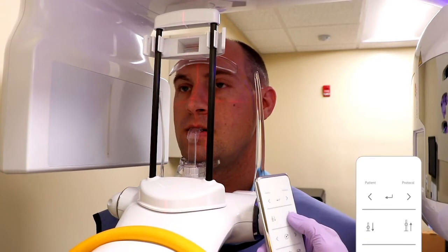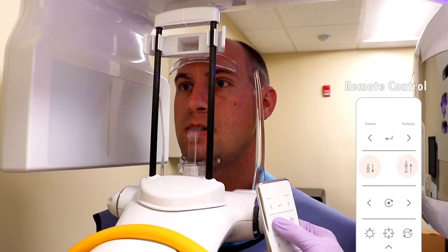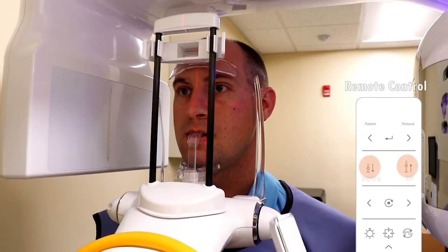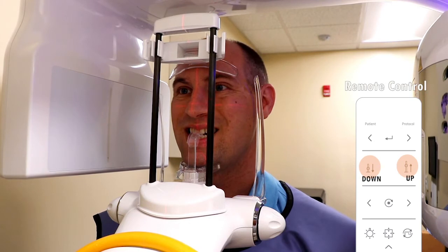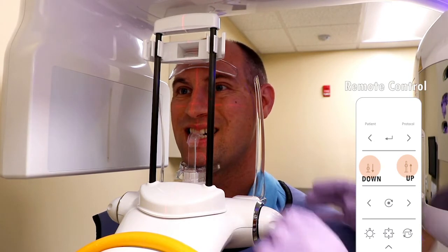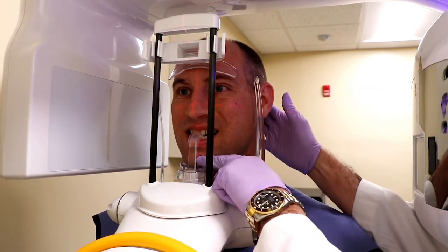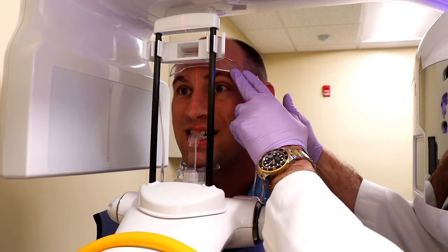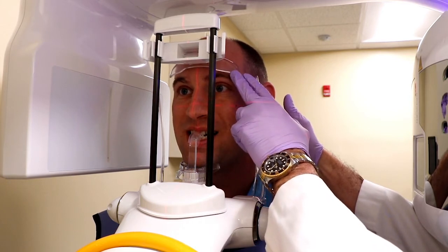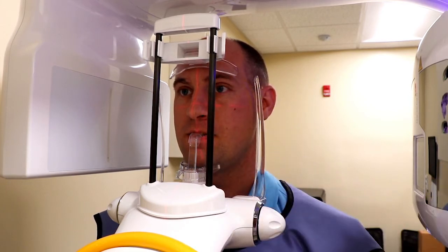Adjust the height using the remote controller so that the patient's face is straight. Adjust the horizontal laser to the patient's Frankfurt plane.